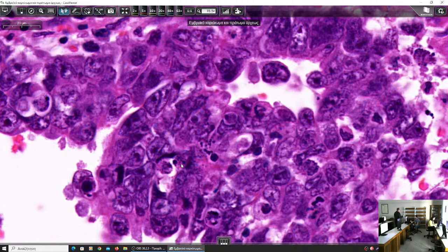Mitotic. Increased mitosis, and the other ones that are like dust, the nuclear dust, you can see here. They are separated. Yes, this is the mitosis. The ones like these ones here, this is the mitosis, all right? These ones, you see, all these small fragments of nuclei. What is this phenomenon? And how is it related to the chemosensitivity of the tumor?